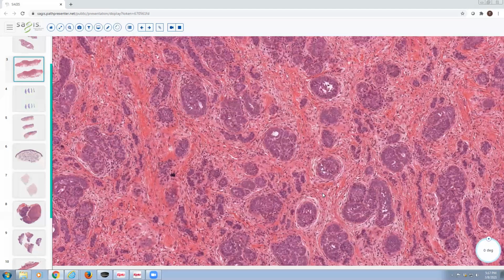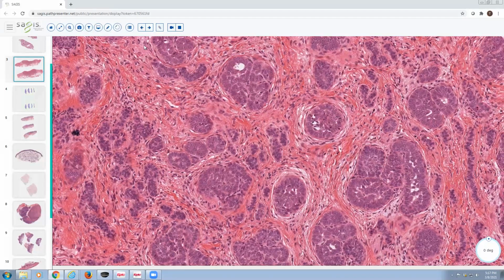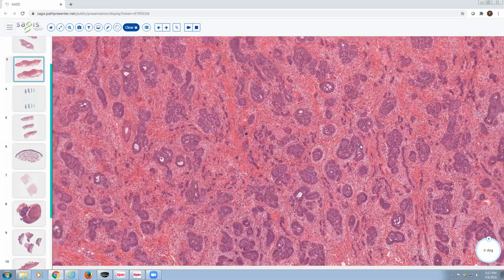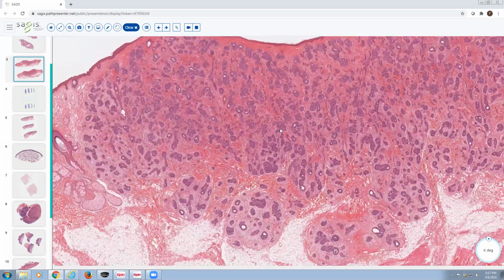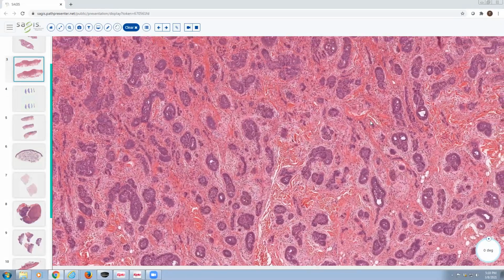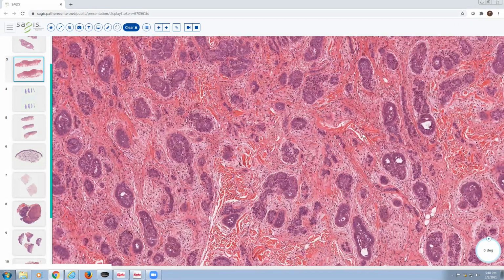And in trichoblastoma or trichoepithelioma, the retractions are actually stroma to stroma. So I see a little cleft here. It's not between the tumor and the stroma, it's actually between little strands of collagen. So stroma to stroma clefts, which would be the typical pattern in trichoblastoma, which is what this is. So we've got our basaloid epithelial cells arranged as nodules situated within a cellular and fibrotic stroma. There are stroma to stroma clefts, but not tumor to stroma. So here's another stroma cleft.